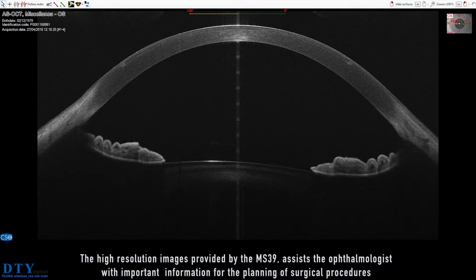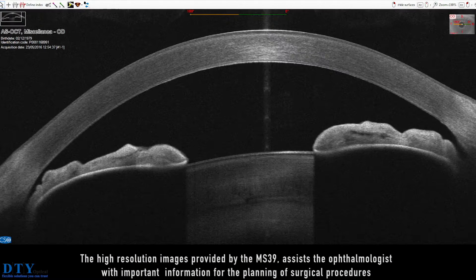The high-resolution images provided by the MS-39 assist the ophthalmologist with important information for the planning of surgical procedures.